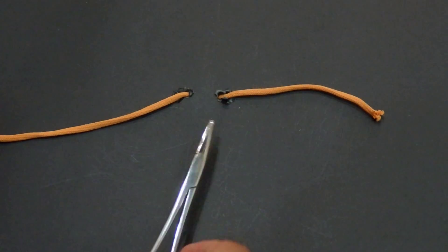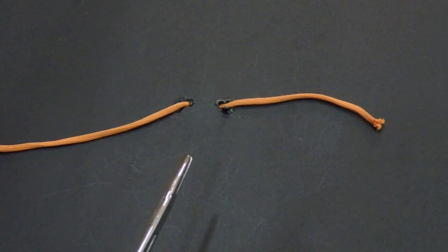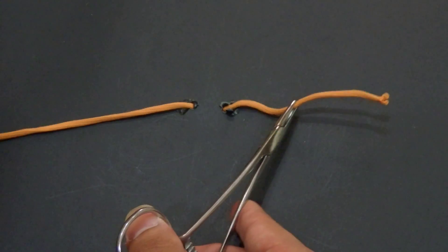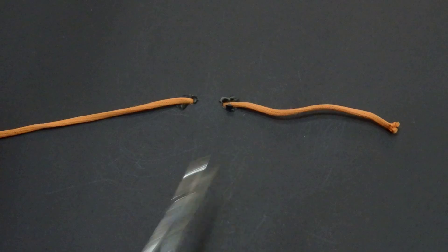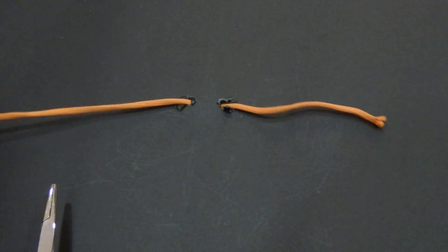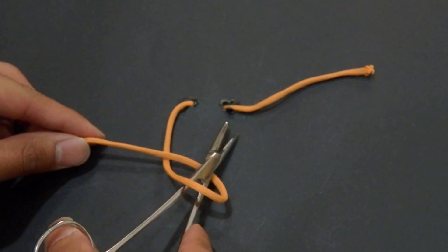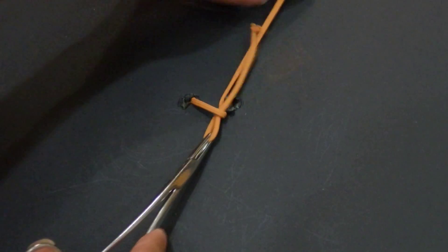Common mistakes while suturing using the needle holder. The first common mistake is making the free end too long. The second mistake is holding at the base instead of the tip — when they hold the base, they will struggle.